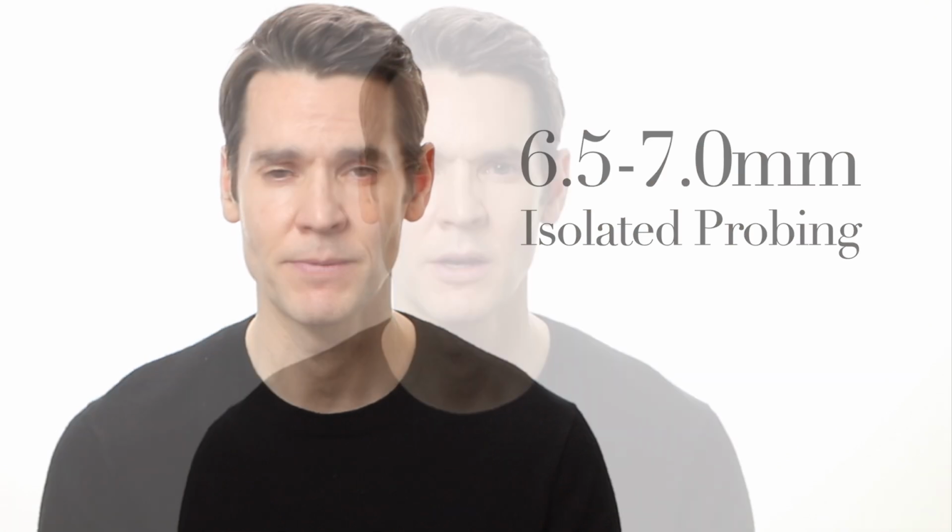That's significant. We shouldn't always rely solely on our two-dimensional imaging to determine the condition of that surrounding bone. And regardless of which method you choose, either cone beam CT scan or probing, eventually you would have picked up on the fact that there's a crestal bone defect there on the distal. And the screening system would have led you in the right direction.